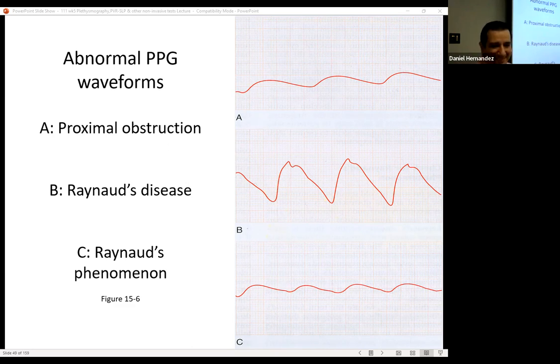Well, wait, this is not a Doppler wave, this is a Pleth wave, right? Yes, this is plethysmography. Would it be the same on Doppler? Don't they look inverted? We established that in a sense. Technically I'm not saying it's inverted, I'm just saying it looks like that. It's a W sound but backwards.